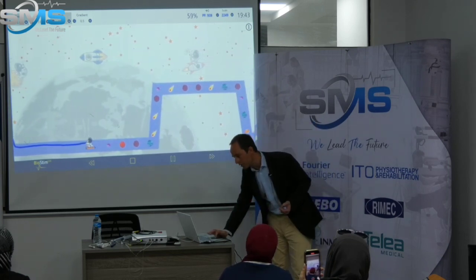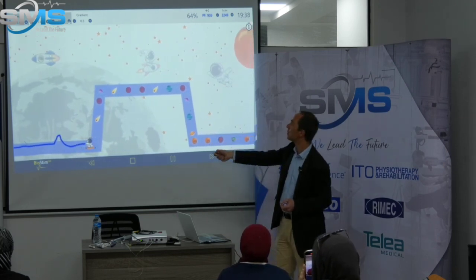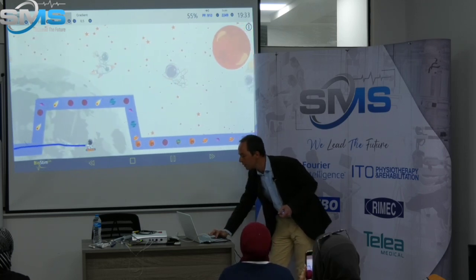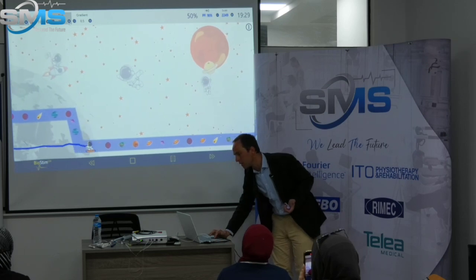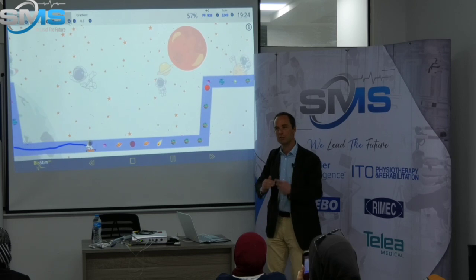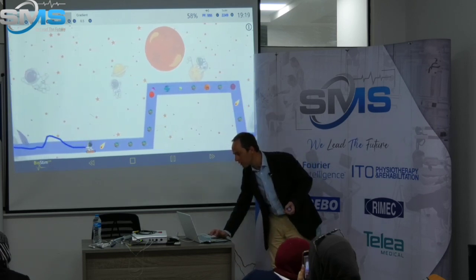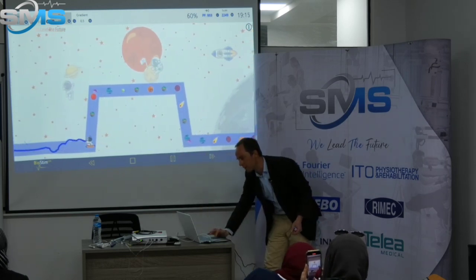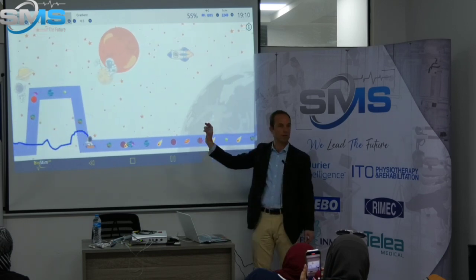So you can adjust everything. Here you see on the top, here we have some specific adjustment parameters. I can decrease the size to make it easier. Or sometimes during the first session we can increase, because when the patient starts to understand, she's getting better. And you can also adjust work time, because sometimes it becomes too long. She cannot get it after 10 minutes. So we are making it smaller.